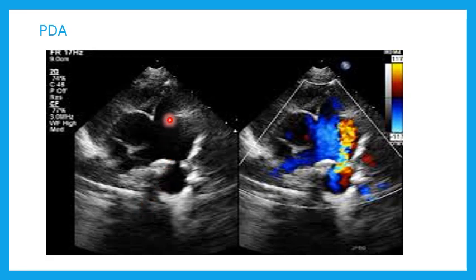We can see the pulmonary artery, the right pulmonary artery and the left pulmonary artery, and usually the flow is going away from the probe, so it would be blue. But the PDA flow, being in a different direction, is going to be red. So we can see this red flow. This is the PDA.